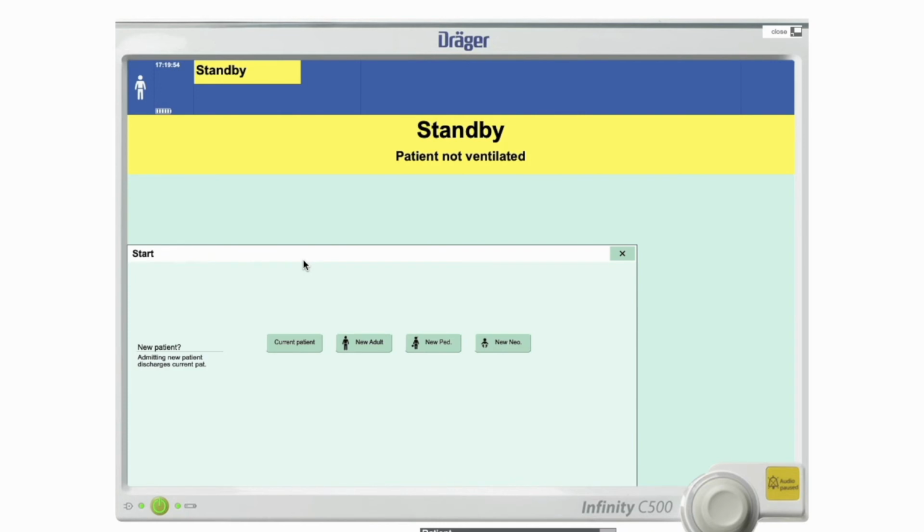You'd also want to know what drugs the anaesthetist has given during theatre, and when last he had anything that was sedating or muscle relaxing. And then you'd want to see the general condition of the child. And based on that, you'd be looking to put the child on a ventilator. The last question you'd ask the anaesthetist or the surgeon is whether or not there was a plan for the child to be extubated quickly, or whether or not there was an expectation he'd need ventilating for a period of time. Either way, this 10-kilo baby, in my opinion, given that story, would not extubate quickly, and therefore I'd be setting him up to get on the ventilator pretty sharpish.